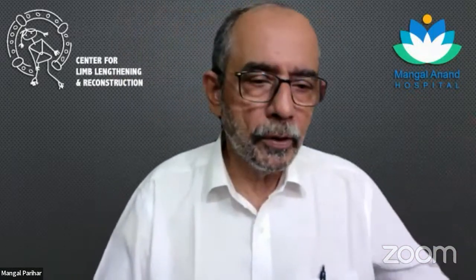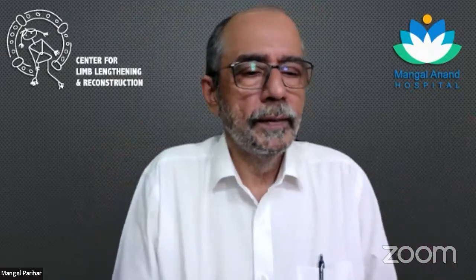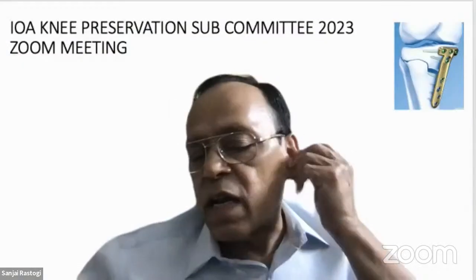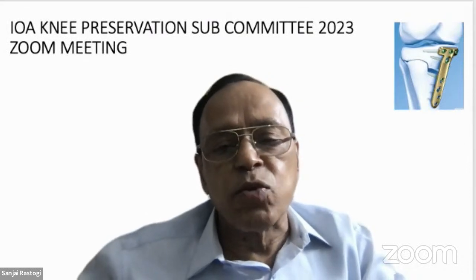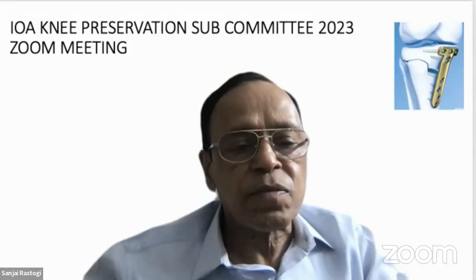And that technique works whether you're doing proximal tibia or distal radius, anywhere you don't want the screw to go through, you can use that. I think it's called the woodpecker technique. Yes, probably. And you don't throw away the cancellous bone which gets into the drill bit. That's another advantage. You just compress the cancellous bone into the hole.